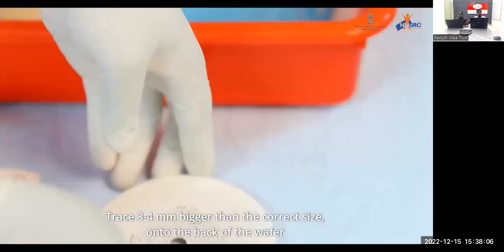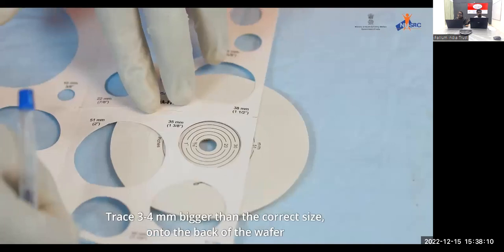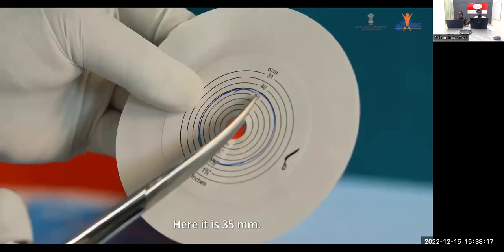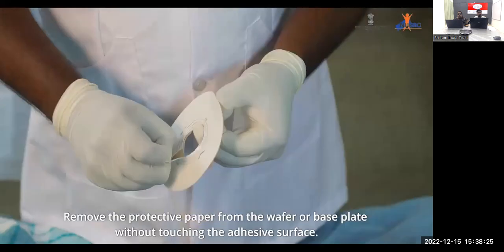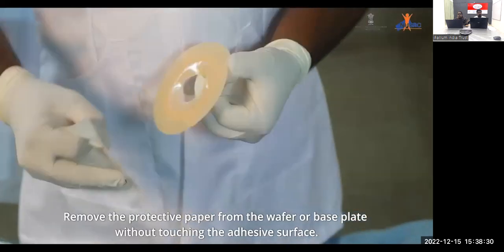Trace 3 to 4 millimeters bigger than the correct size onto the back of the wafer with the starter hole in the middle with a pen. Here, it is 35 millimeters. Cut the base plate or wafer along the trace. Remove the protective paper from the wafer or base plate without touching the adhesive surface.